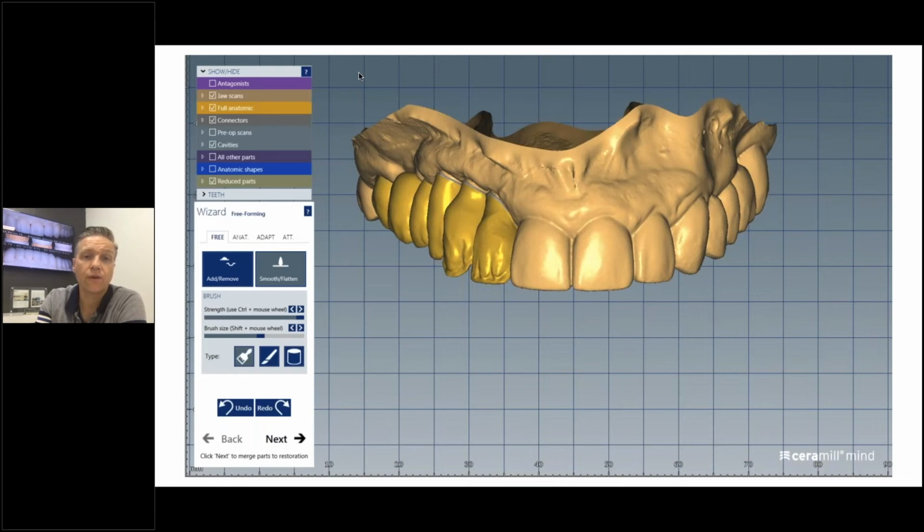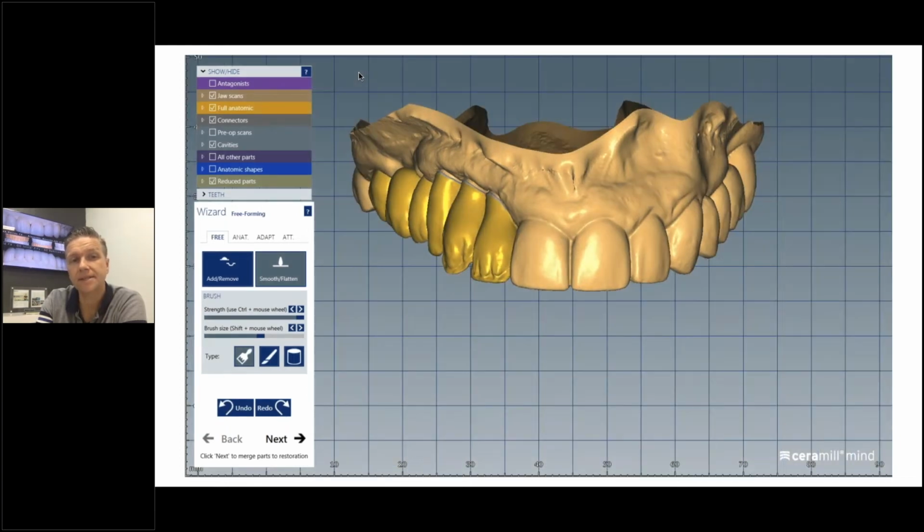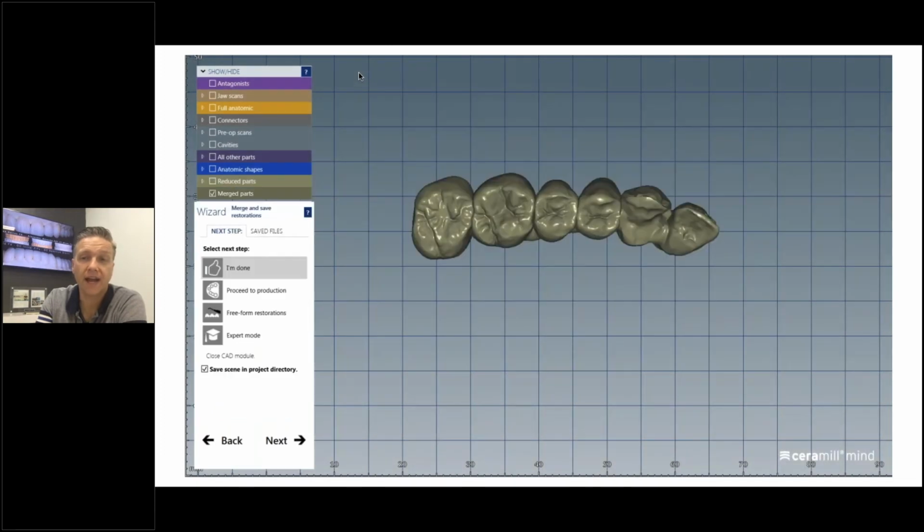I can then go through a free-forming process to refine my coping shape and my anatomies a little bit. And here, just a different view. I have a nice finish line on the canine and on the lateral, a nice transition basically to the porcelain.